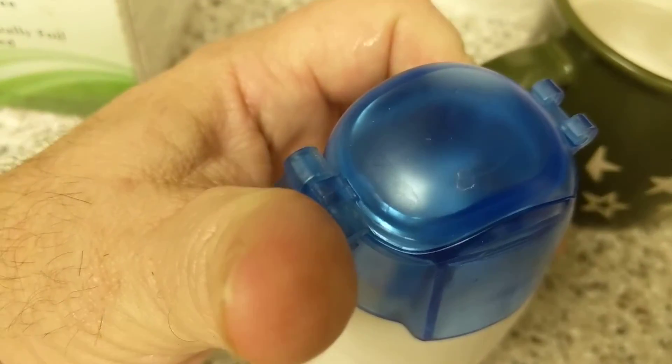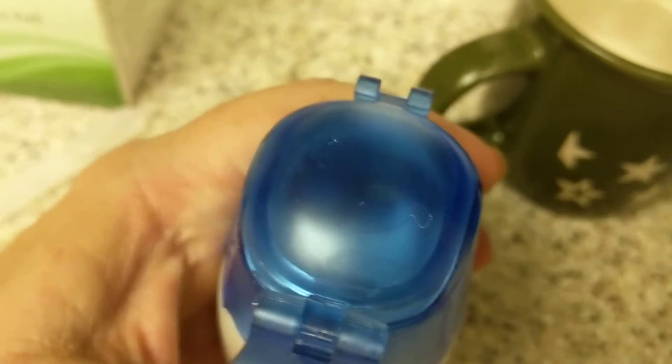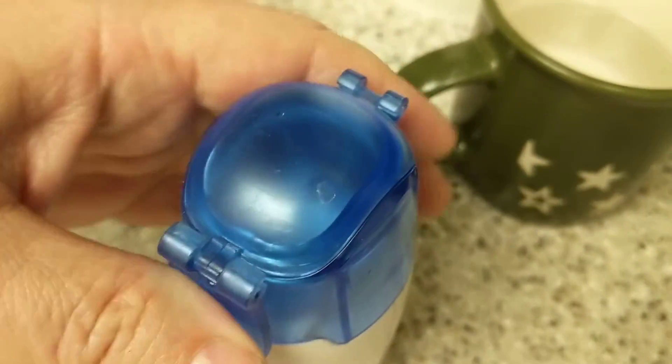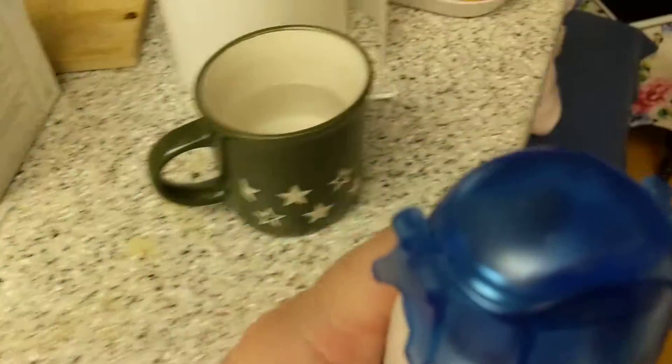That locks down — it's a little hard to do with one hand. And here's Tommy. I'll go ahead and dose him now; I've already shown how I do that in a separate video.